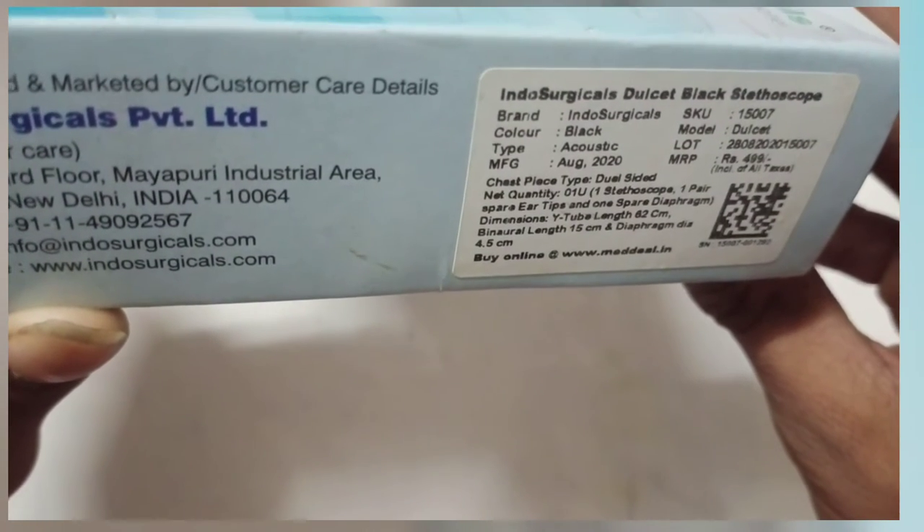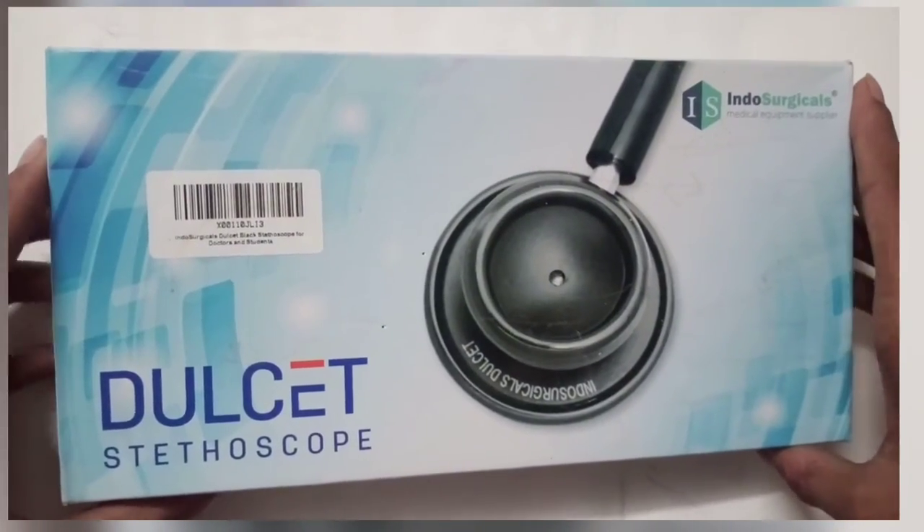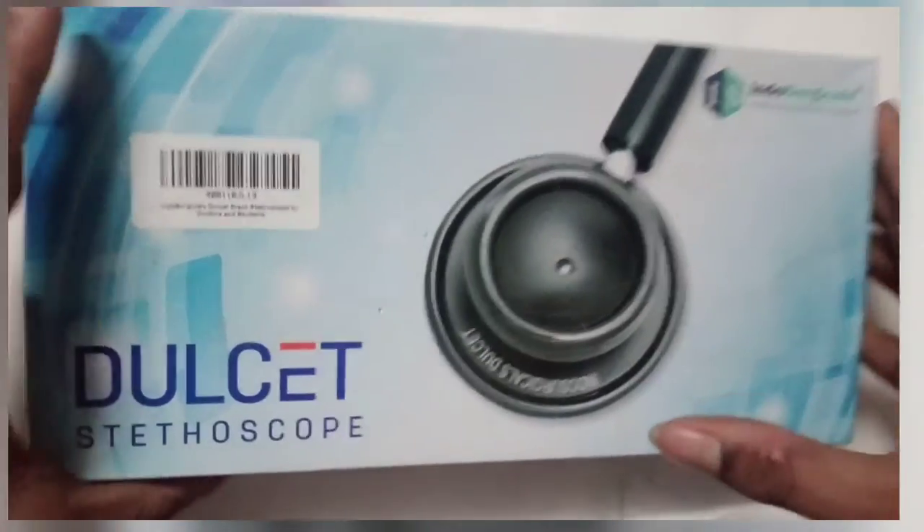This is the cheapest price — cheapest Stato Scope. Now let's unbox this.